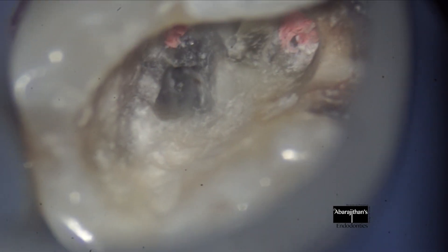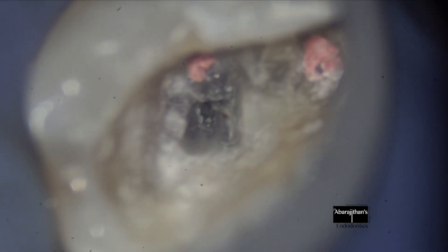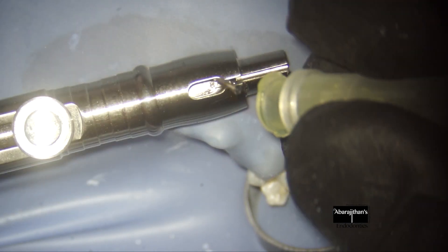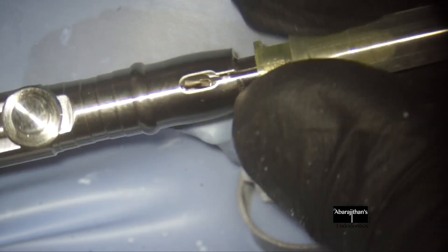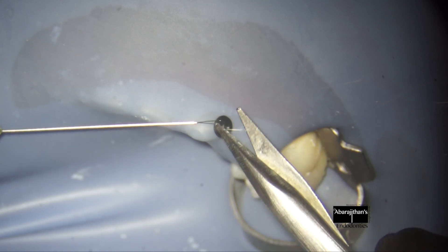You can see I am clearing up the debris that is being packed, using a Stropko-like three-way syringe from Ultradent. And now we use the micro loop — in this case, I am using the BTR pin.